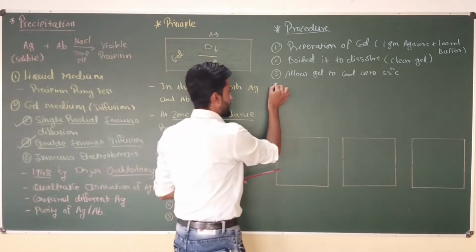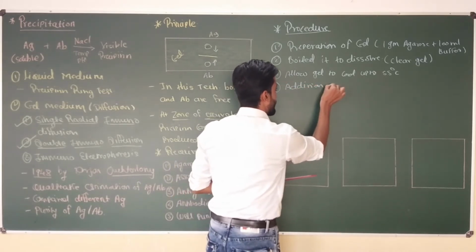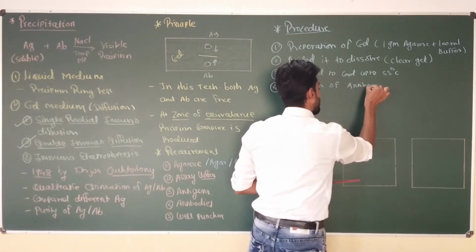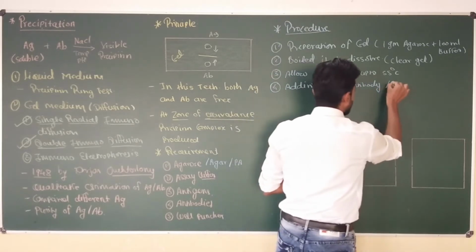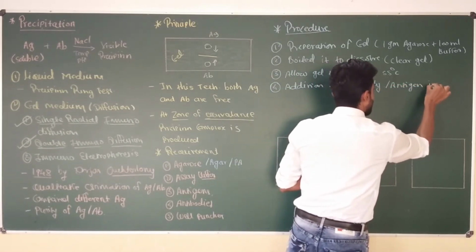The next step is addition of antibody and antigen in wells.